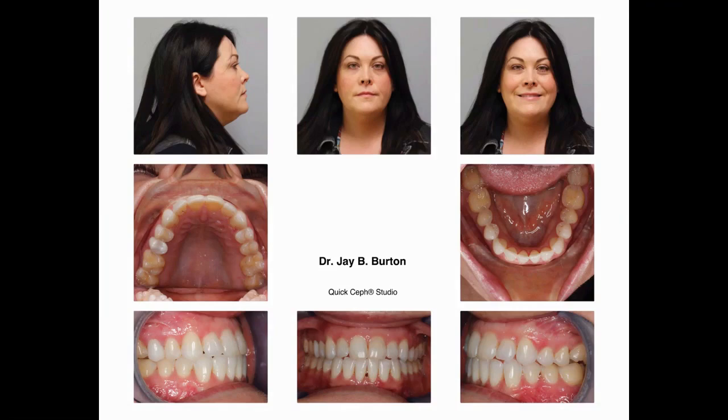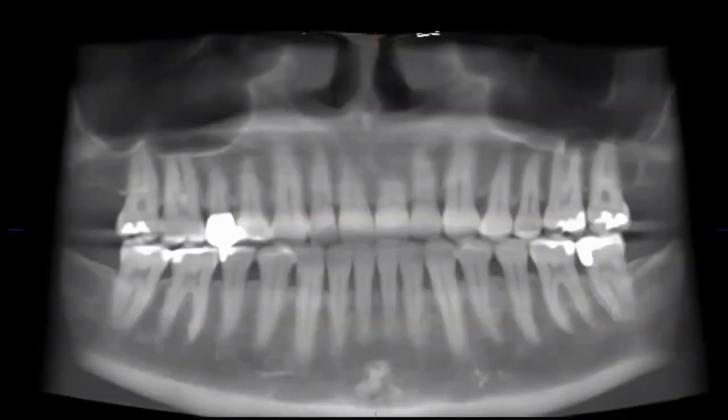I would have a lot of orthodontists say to me, oh, you don't need additional records on a case like this. I mean, it's really just very, very mild crowding, and not a whole lot of necessity, certainly for 3D in this case. But that's not how I want to practice. And so part of my standard protocol is CBCT on every patient. And in doing so, this is the 3D rendered pan. So there's not a whole lot of information that changes much when it comes to that.